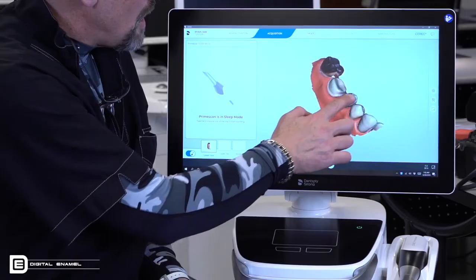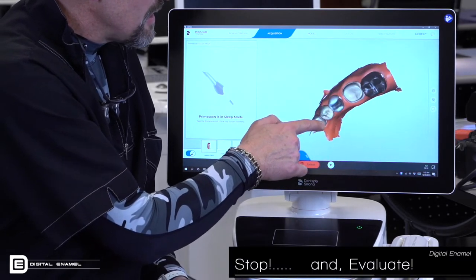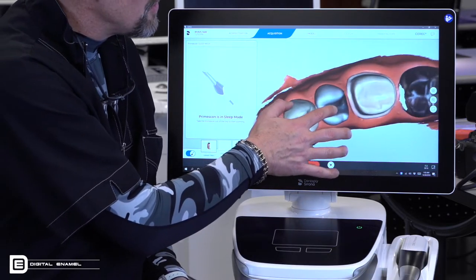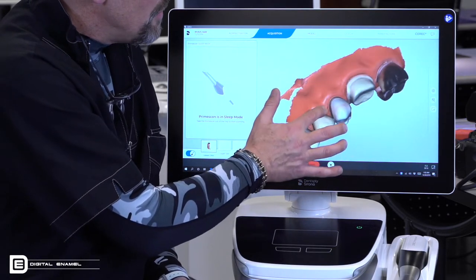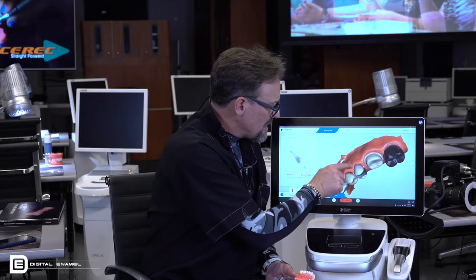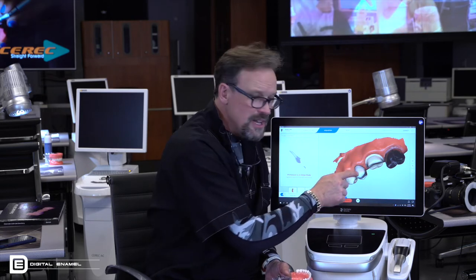So now you look to see what you need. Now obviously, on this model, there are areas that need to be filled in, like the distal of this premolar, the mesial of this molar. But just on the skeleton, I've got it all. So there's no reason to actually start filling more in through here and more and more. All that does is build the file size larger and larger.